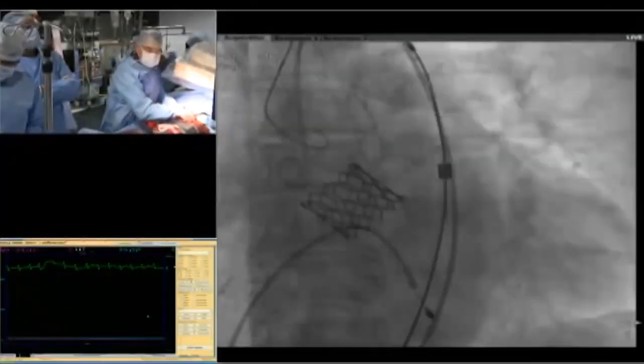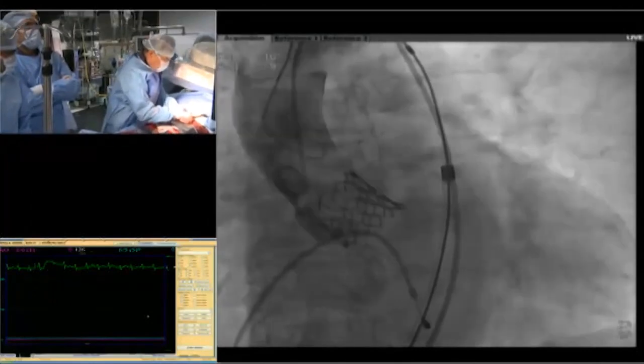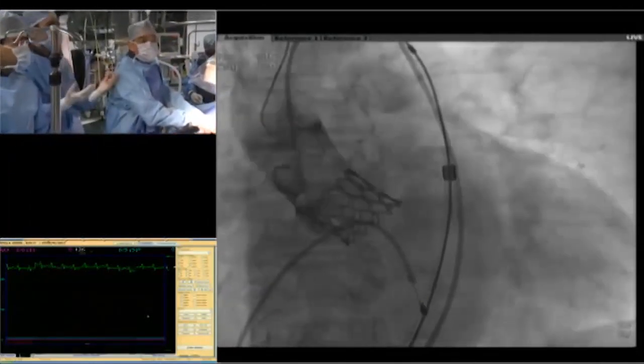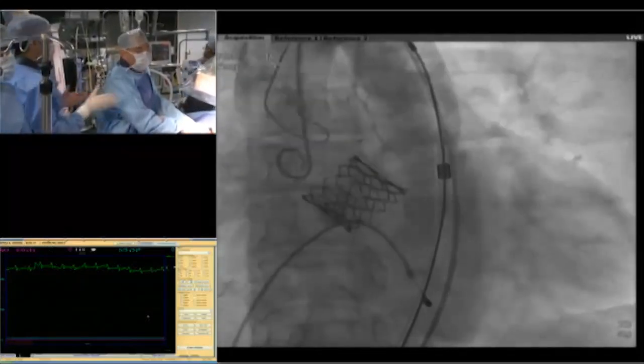Table down, please. Just show the last picture. Table down. I think that's a good aortogram. We just see a whiff of contrast. Give a call to Raghu. I think we are done. Okay. We're okay. Right? Yeah.